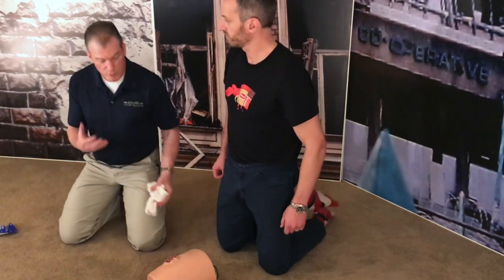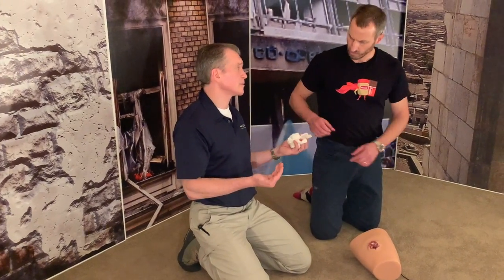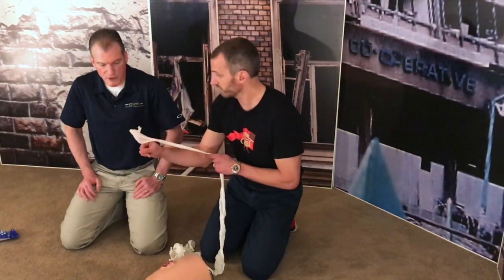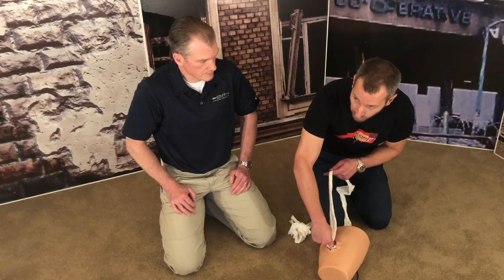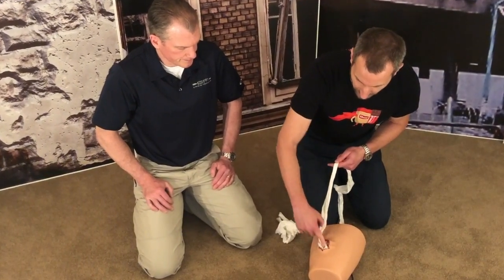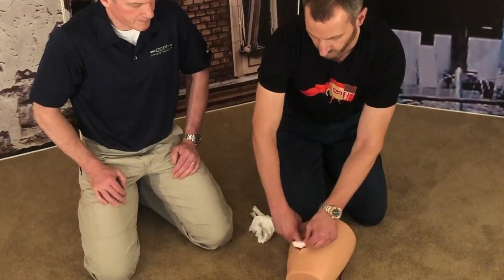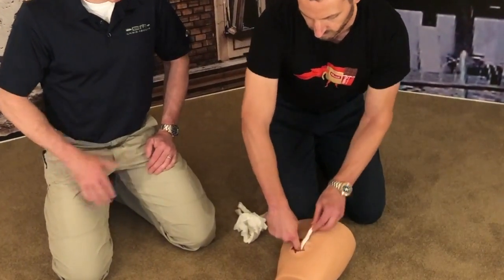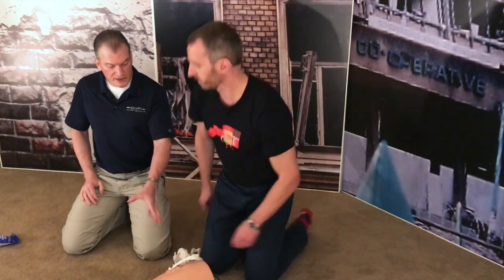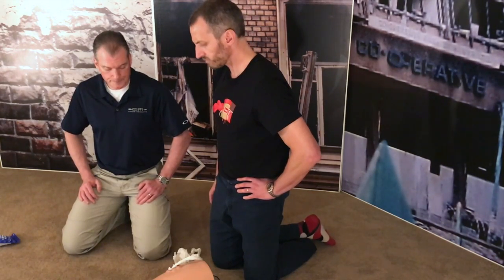One of the keys is you really need to identify the point of bleeding, because you can pack some of these little nooks and crannies, and if you never get to the point of bleeding, it's still going to be bleeding. Your finger needs to be directly at that point. Then you go in, feel that point, release, make a little cup with the gauze, and it goes in naturally. Feed it to yourself — this hand packs, this hand loads. It's like a sewing machine: in and out, in and out. For a wound this size, packed aggressively, it takes about 20 to 30 seconds to pack it — pretty quick.